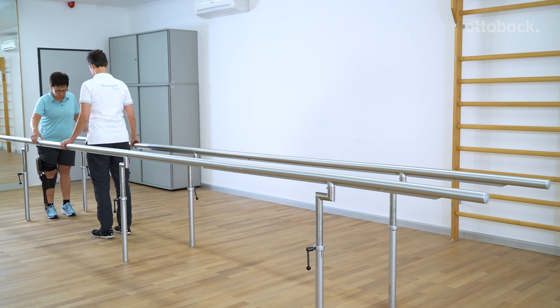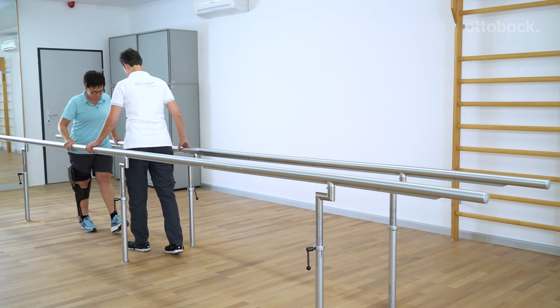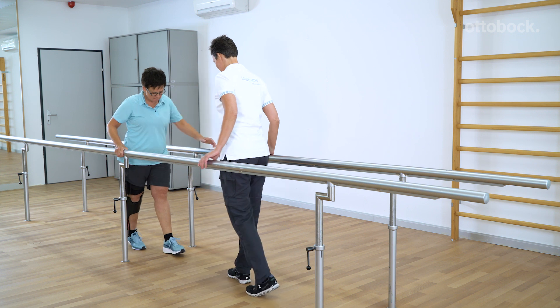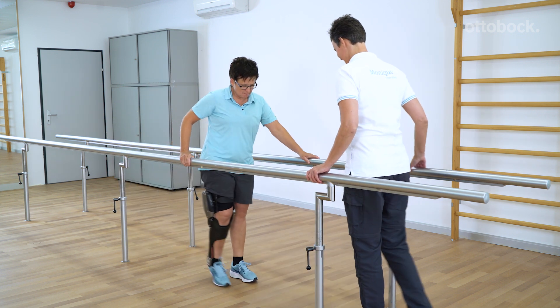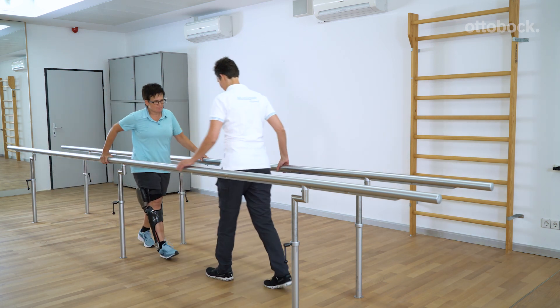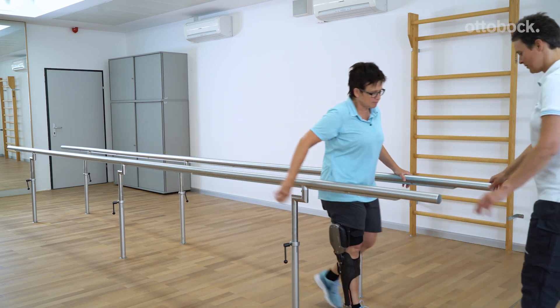The goal of the exercises presented here is for the patient to become as independent of auxiliary devices as possible, depending on their physical condition. Start by performing these exercises between parallel bars. If the patient feels safe while doing so, the exercises can be performed with crutches and canes outside the parallel bars.